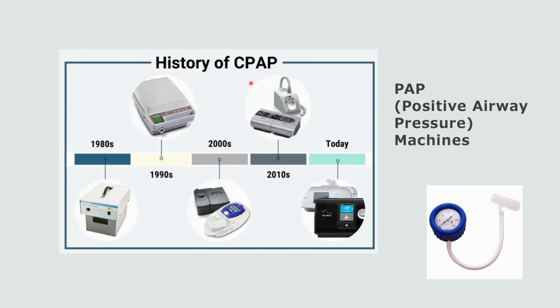Into the 2010s, PAPs became more personalized. We had PAPs for him and her. There are some travel PAPs available. They used SD cards, which could store information that could be turned into the doctor for compliance and treatment maintenance. And they also had nice digital screens instead of the LCDs. Now, PAP machines have wireless internet capabilities so that the physician can download compliance information from their office. A lot of insurance companies demand compliance downloads to pay for the patient's treatments.